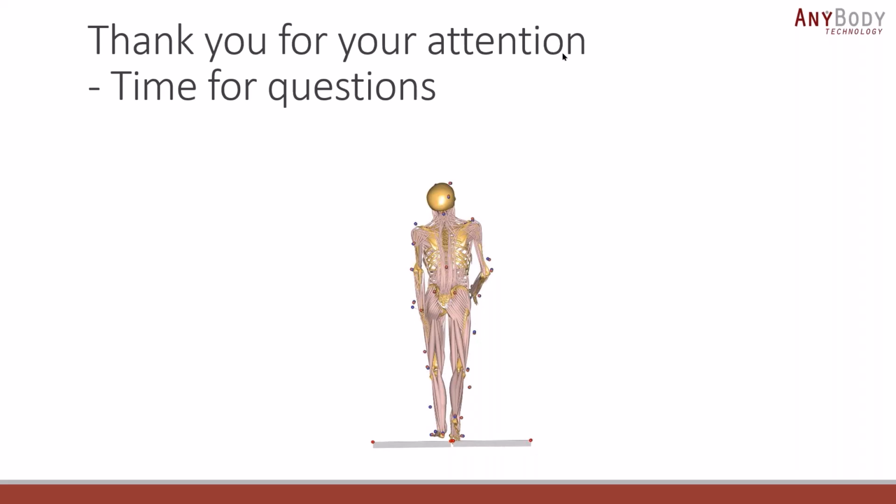And about the loading conditions, in this workflow, we tested only a knee extension motion, and it was unloaded. It was difficult to know the external forces applied to the model. So we decided to simulate an extension movement unloaded and only assisted by the gravity. But in principle, we could test more movements. We have done this previously, if you also look at the previous webcast. But it is important to highlight here that this particular movement is also important for the intraoperative procedure, because it is typically performed by the surgeon to assess the soft tissue laxity. So ultimately, they can achieve a balanced knee motion.